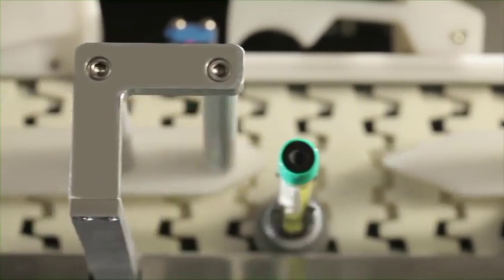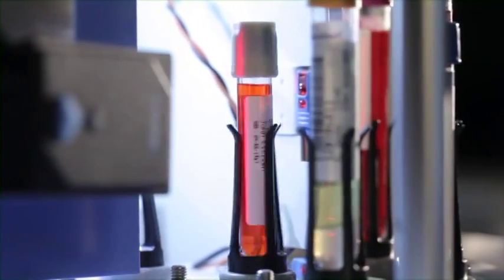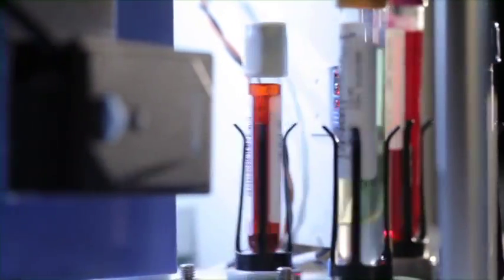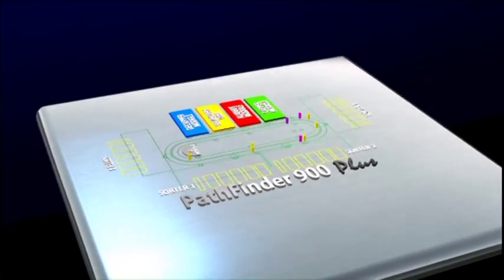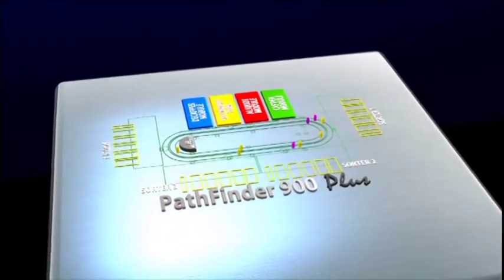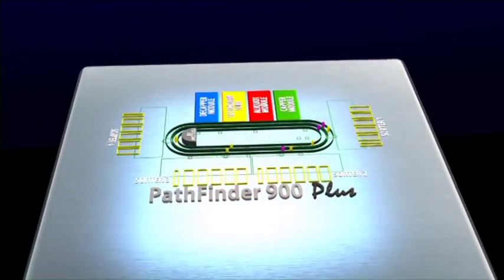While the conveyor track and the ID module are always an integral part of the basic system, there's some flexibility in what other modules can be included.